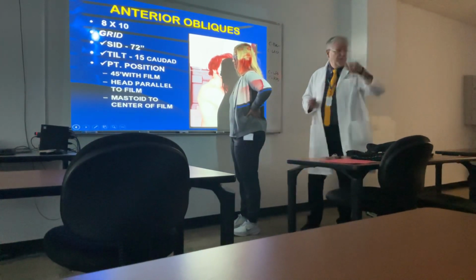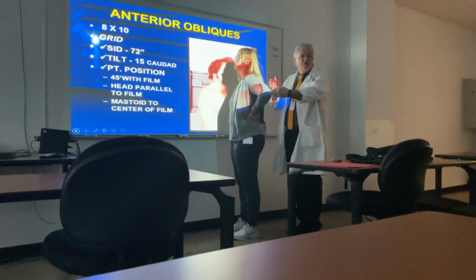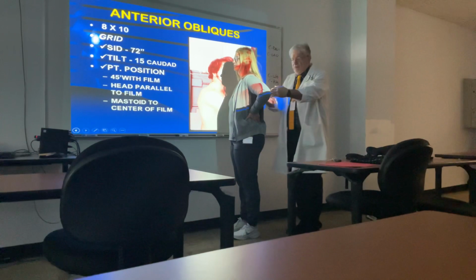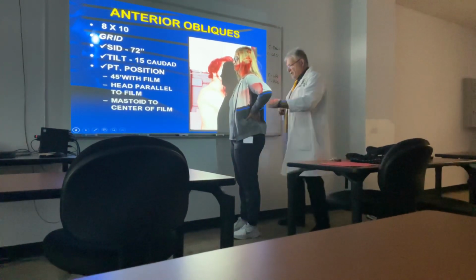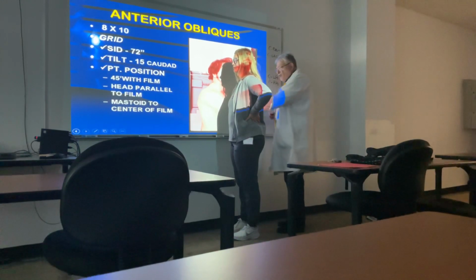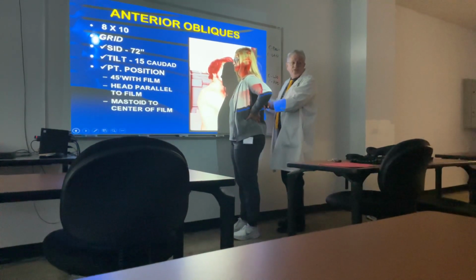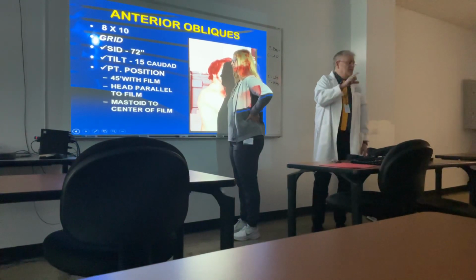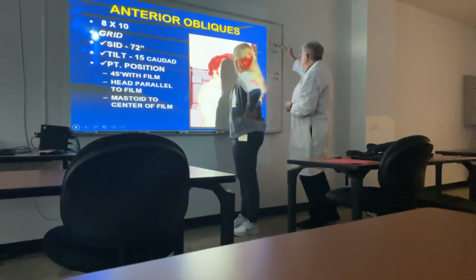The X-ray beam is coming from the projector. It hits this elbow. It can go through this elbow, but is it going to show you a clear opening of her foramen that we've just created? No. But on the right side, the X-ray beam can go right through and leave the edge that I created with my hand on the X-ray film. So on a right anterior oblique view, which IVF do we see the best? The right side.